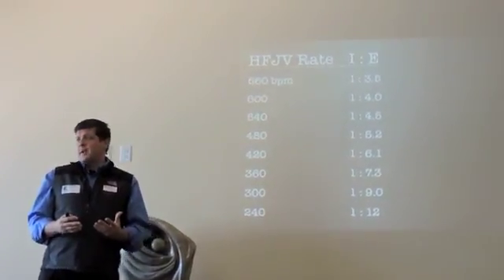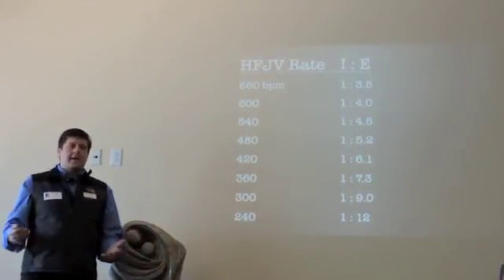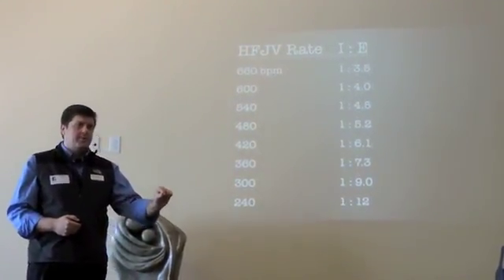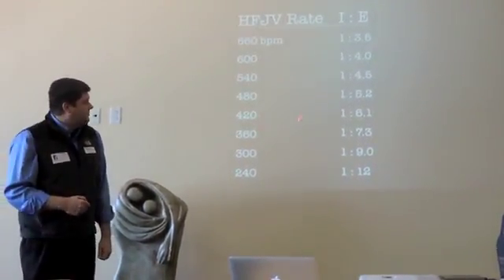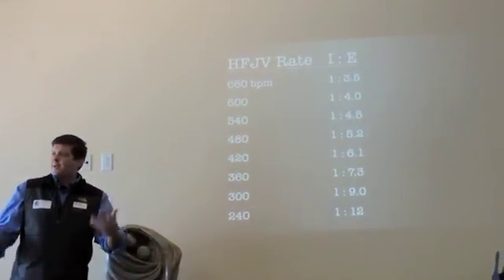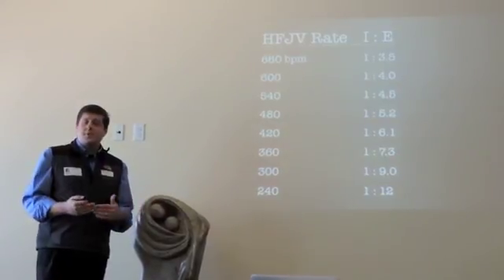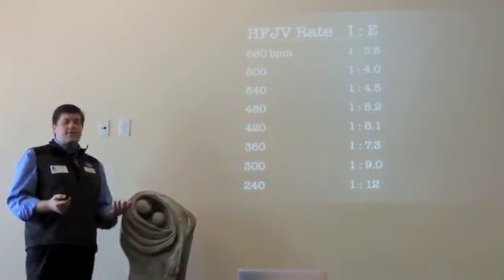If your x-ray is overinflated and you're gas trapping, drop the jet rate. If you get down to 320, it's a 1 to 8. A 300 is a 1 to 9. You get down there in that range, now you're really pushing towards getting that gas trapping and that overinflation taken care of. And then subsequently, if we're taking care of a little micro preemie, 24 weeker, 400 gram, 500 gram, his lungs are small, they're stiff, he's got very tiny volume, so his resonant frequency range is more up here. Don't be afraid to go up to 480 or 540 even if you have to, okay?